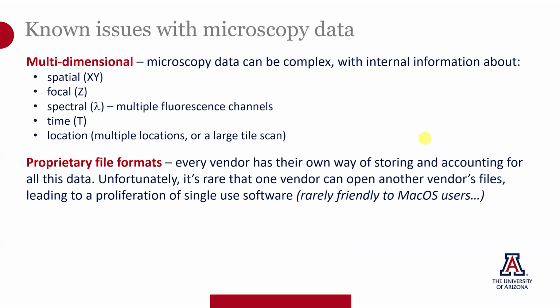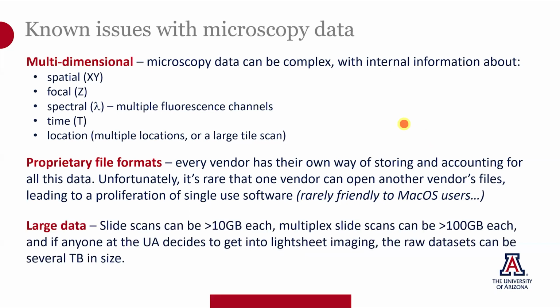And it's rare that one vendor can open another vendor's files, so it leads to this proliferation of single-use software, which is rarely friendly to Mac users because very few scientific softwares run on the Macintosh OS. And the files can get very large. Slide scans can be 5 to 10 gigabytes or larger. If you do multi-channel fluorescence slide scans, they can be in excess of 100 gigabytes.